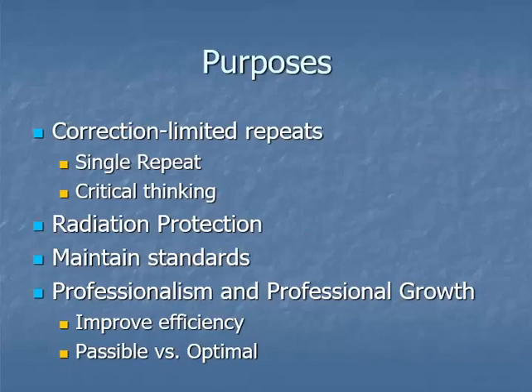So the purposes for studying critique would be to limit repeat exposures, not just in a single exposure, but we're going to go back through positioning as well, so that it's a refresher and a reminder of exactly where we position for particular images. But if you perform an exam that needs to be repeated, you should be able to analyze your image and determine exactly what you need to do in order to correct for the mispositioning or the wrongful exposure, so that you can limit your exposure to a single repeat.